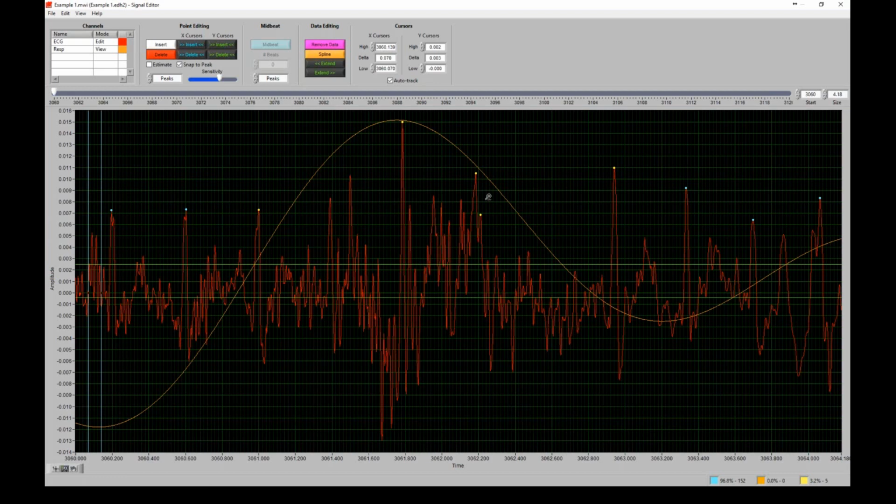But looking at a 60-second segment, we now have the freedom to delete data in the beginning of the segment or the end of the segment and still report the values that we learned from that segment as indicative of what happened during that period. And so that's the easiest thing to do here, and that's what I'm going to recommend we do. So I'll just show you how to do that.